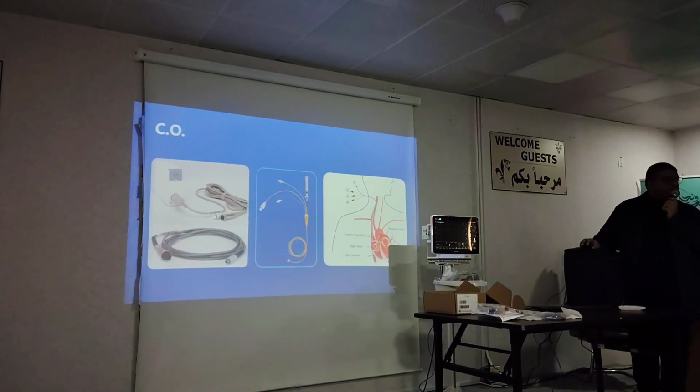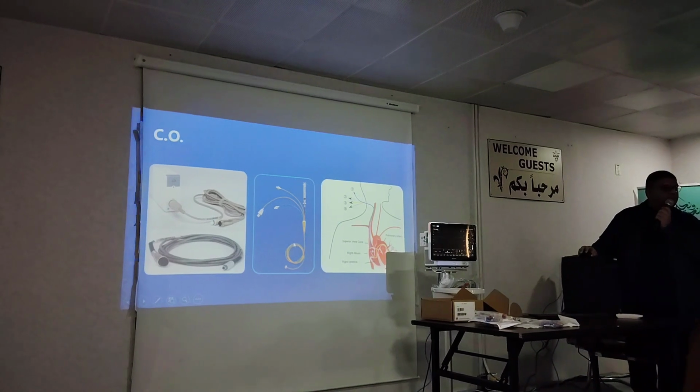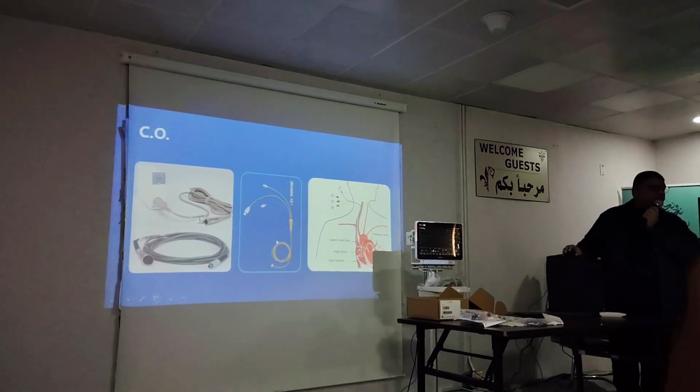This is the invasive cardiac output. As you know, this is the Swan-Ganz catheter. You guys know this one? Anybody who has done cardiac output?